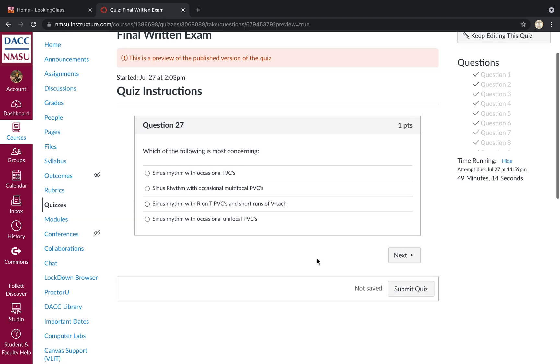Which of the following is most concerning here? Sinus rhythm with runs of PVCs. Short runs of VTAC would be most concerning.